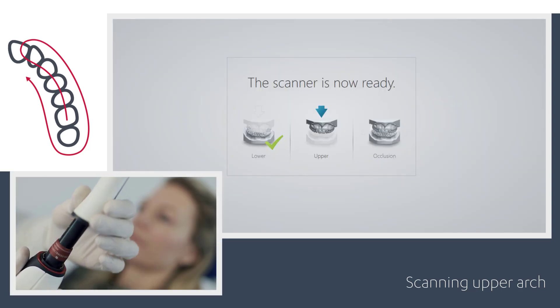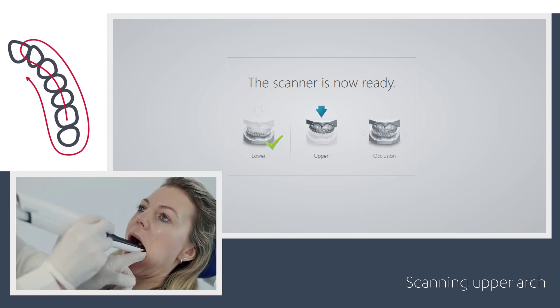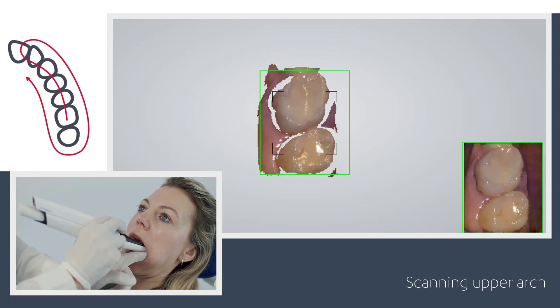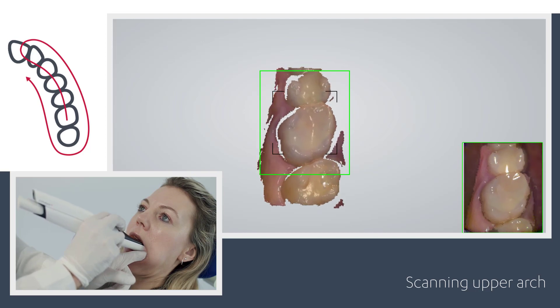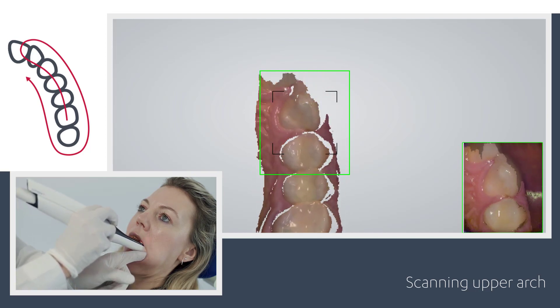As an option, you can choose to turn the tip up for easier upper arch scanning. Use your finger or a dental mirror to create space between the teeth, lips, and cheeks if necessary. Start the scanner while it rests occlusal on the first molar, wait three to five clicks, then move towards the canine while the scanner captures the occlusal surfaces.